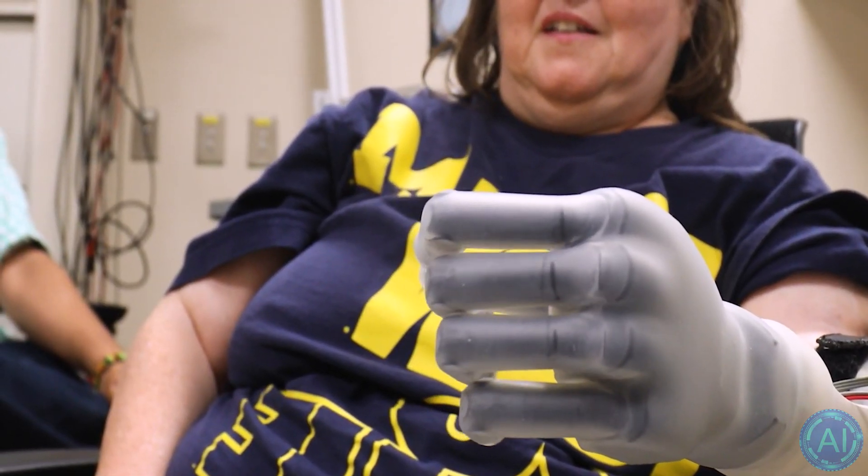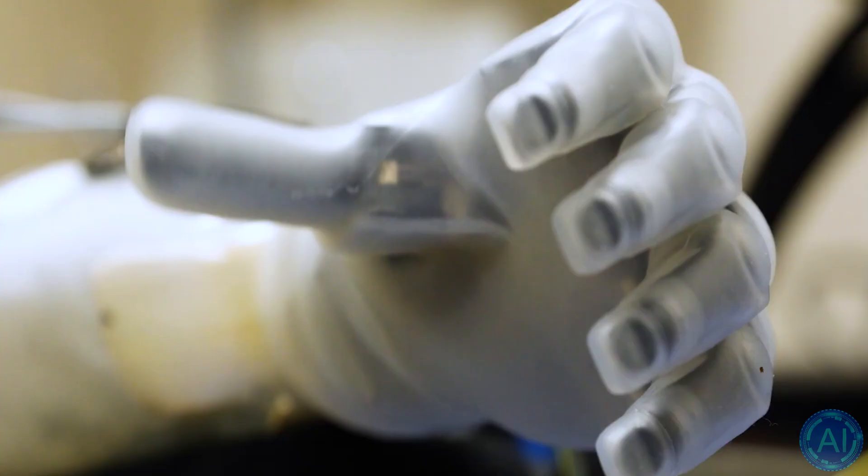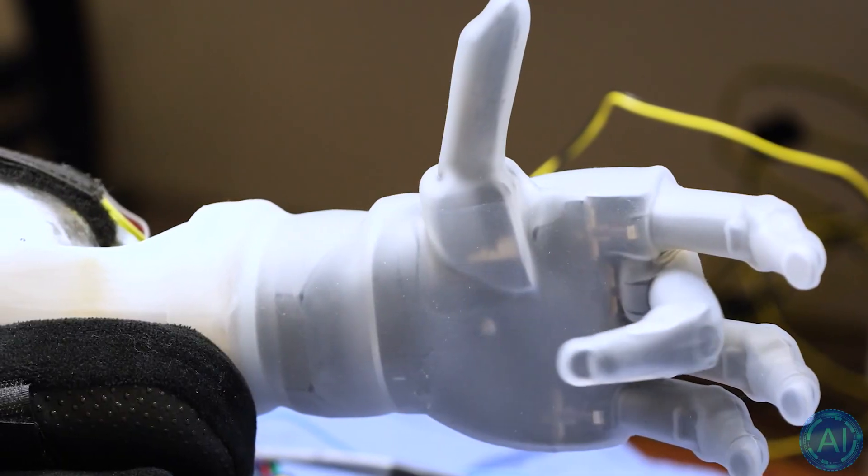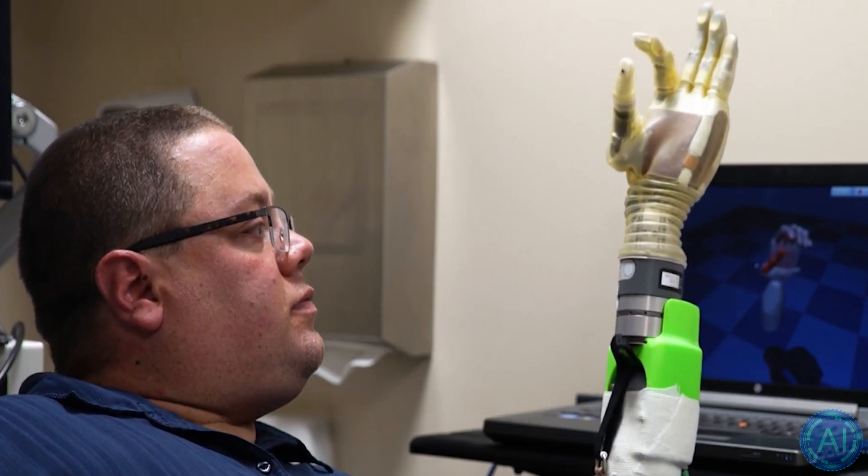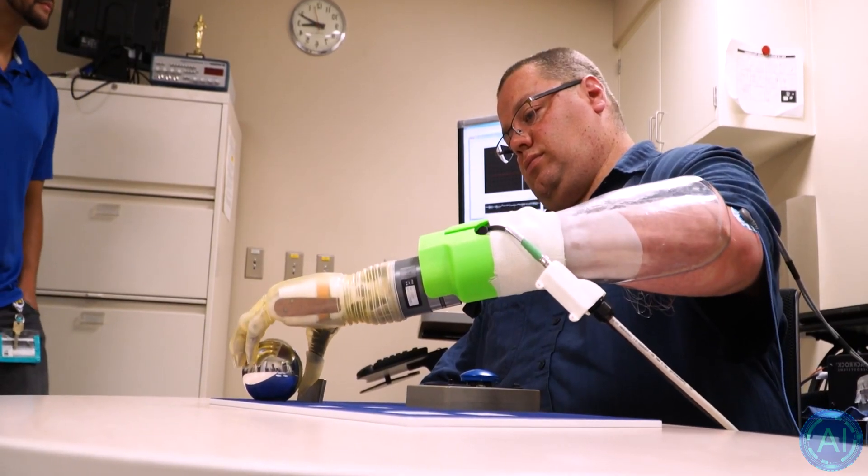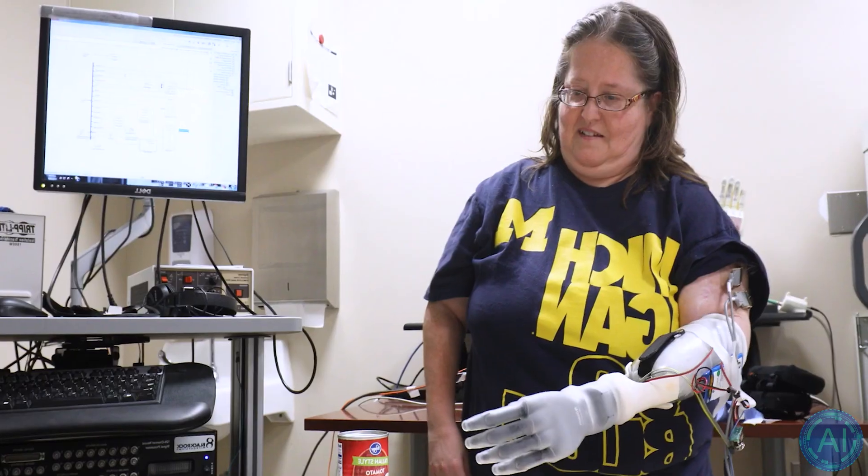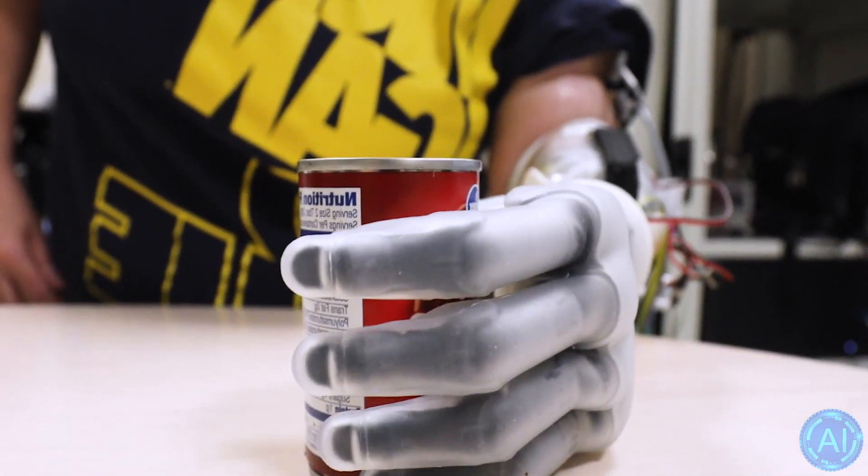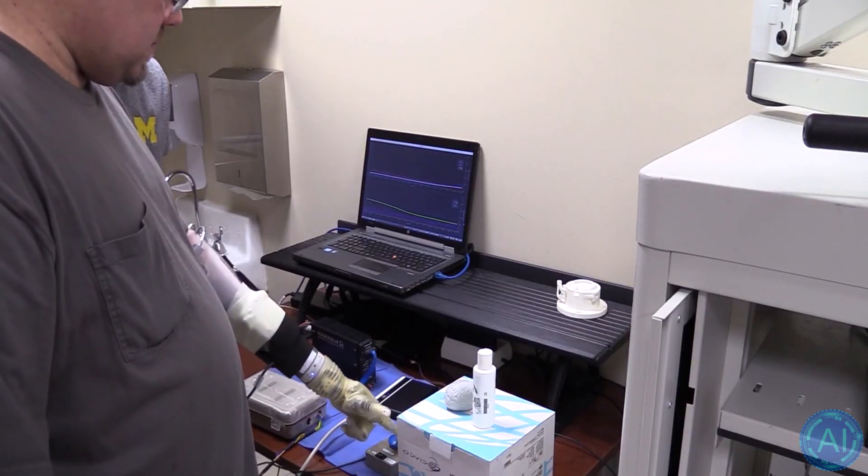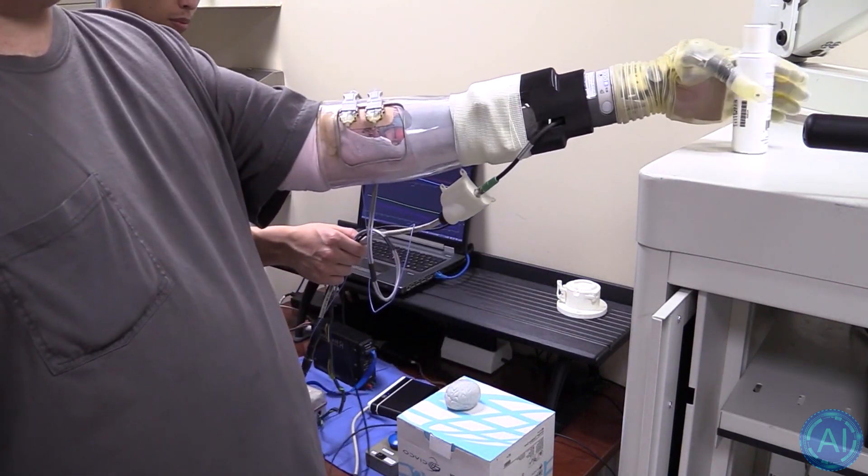Just recently, back in 2020, researchers found a way to detect really small neural electric currents inside an amputee's arm that used to go undetected due to their voltage being really tiny. Recording these tiny electric currents enable really precise finger movements on a robotic hand that almost seem completely normal. Unlike other similar bionic hands, it's especially easy to see how much better and usable they are by the speed at which they're moving the fingers. The users don't even need much time to get used to their new hand.